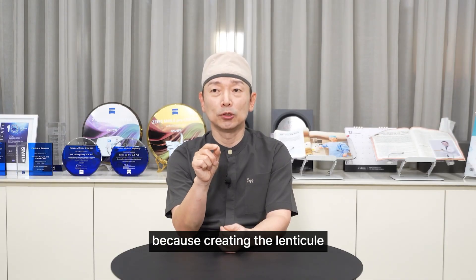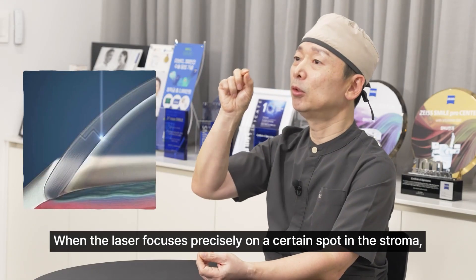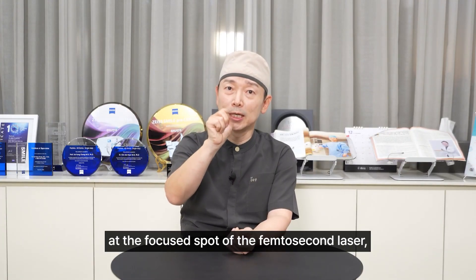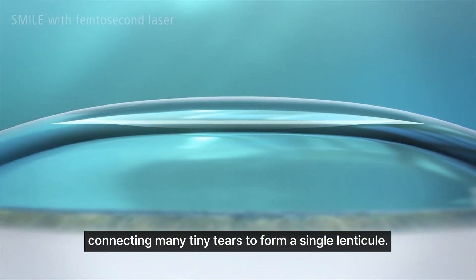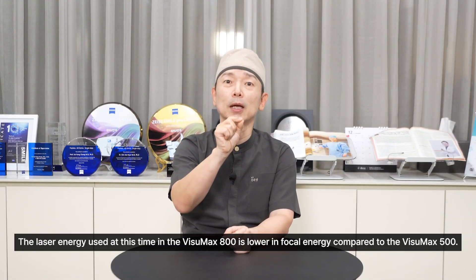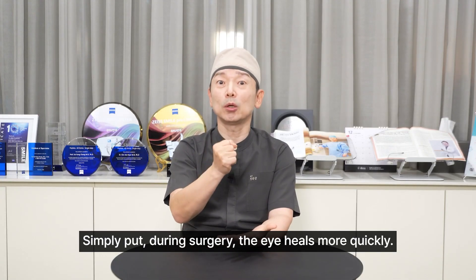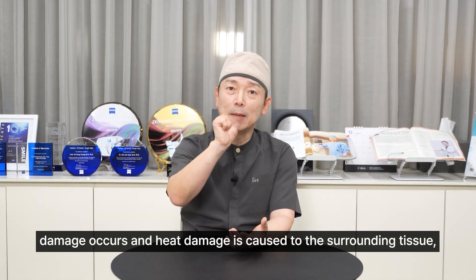Using lower energy is beneficial because creating the lenticule with a femtosecond laser involves photodisruption, which minimizes tissue damage. When the laser focuses precisely on a spot in the stroma, it causes the tissue there to tear. This is called photodisruption, where plasma is formed and gas bubbles develop at the focused spot of the femtosecond laser, causing the tissue to be precisely split or torn. This process repeats, connecting many tiny tears to form a single lenticule. The laser energy used in the Visumax 800 is lower in focal energy compared to the Visumax 500, and this lower laser energy causes less damage and thermal injury to the surrounding tissues.